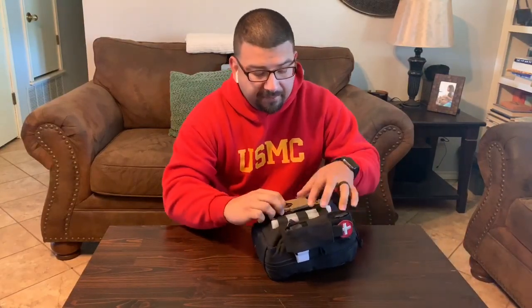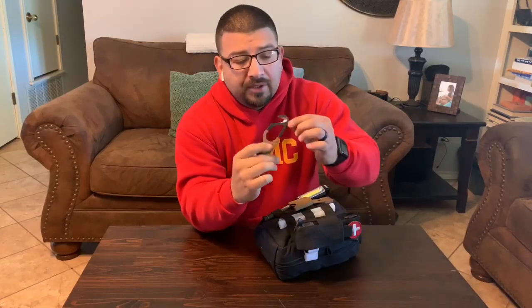The next thing I have is this Gerber seatbelt cutter. You can see there's a little blade right there. If I pull up on an accident, which we go to a lot of accidents, and somebody's trapped in their vehicle, we can't reach over and unbuckle their seatbelt to get them out, I can just hook their seatbelt with this, rip their seatbelt, and then we're good to go. We can try to get them out of the vehicle.